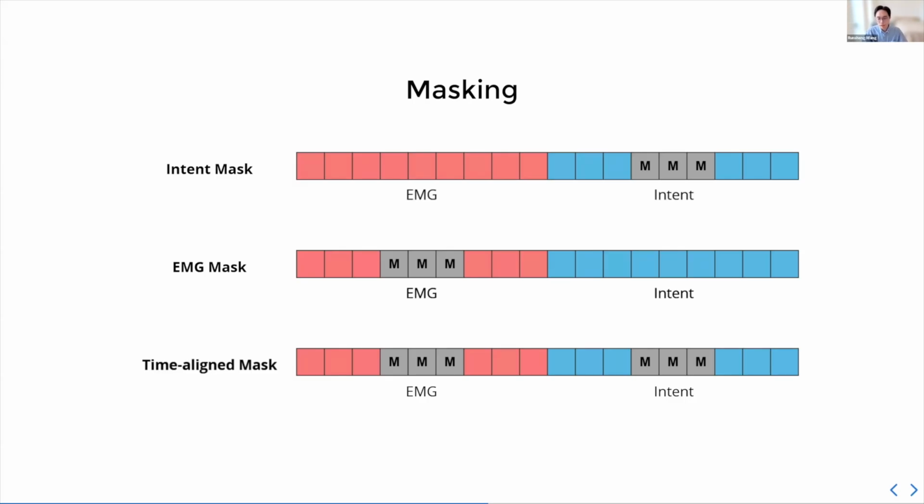And these three approaches together really encourage contextualized embedding of the EMG and the intent to help us better learn this robust feature space that will be used for downstream fine-tuning tasks.